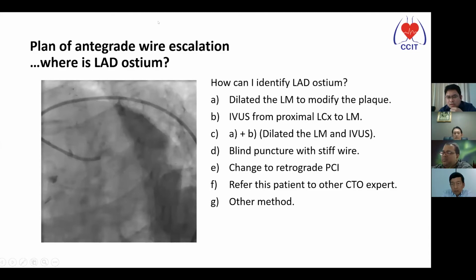I agree with Dr. Nakamura that if we can put the wire into the circumflex, I just dilate the left main and put the IVUS in to see where is the ostium of the LAD and try to do it from imaging guidance. Okay, thank you. So Dr. Viraj, please show us what you have done.